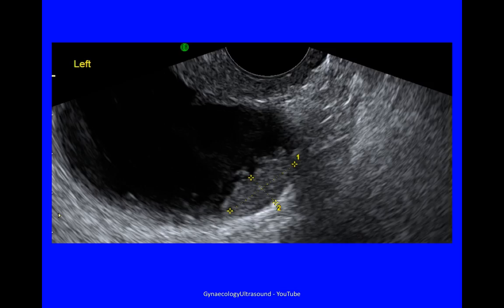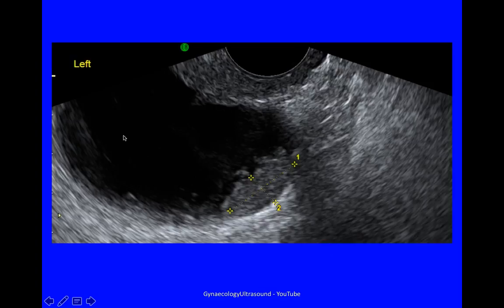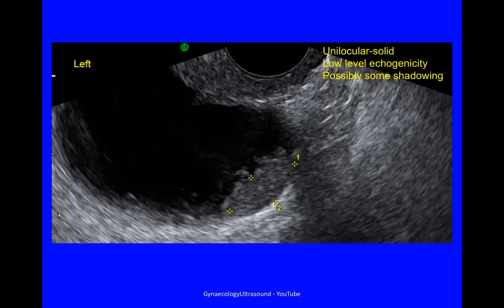This cyst was 87 millimetres — unilocular solid, because it's a single locule with solid material, so it's classified as unilocular solid rather than unilocular. The internal cyst wall is irregular, there is low level echogenicity, and possibly some shadowing. You have to be careful with echogenicity as it depends on your gain settings — if your gain is too low, you will think the contents are anechoic. The next example is a 3D rendered version of a 56 millimetre unilocular cyst with low level echogenicity. You can see a little bit of clumping of mucin at the edge of the lesion.